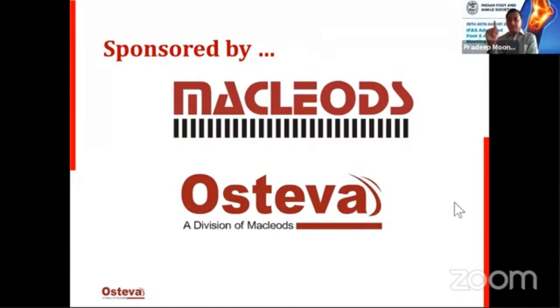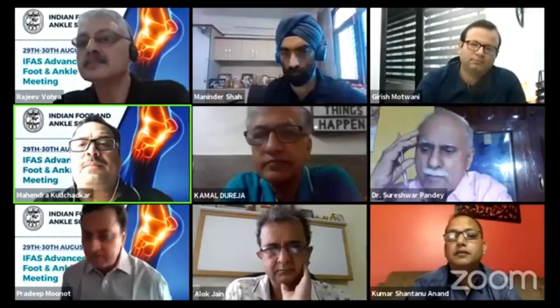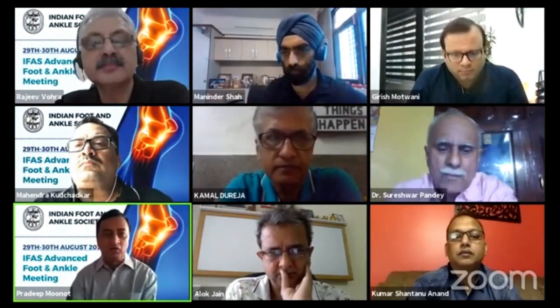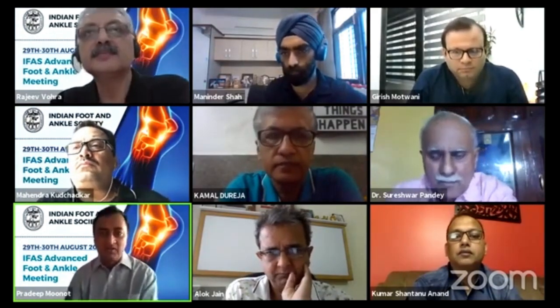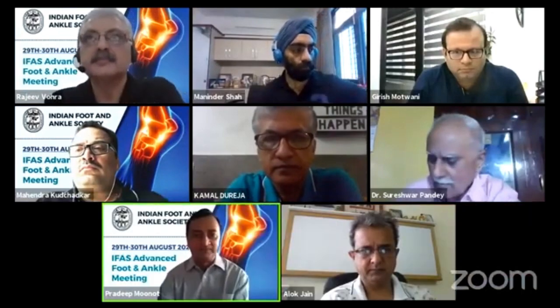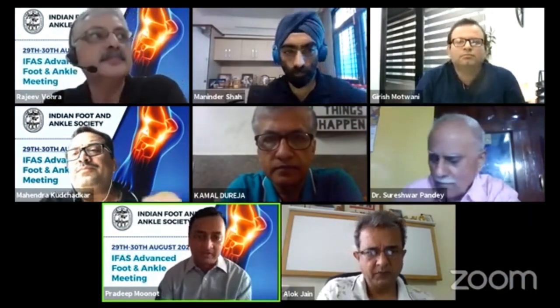Can I add one more comment, Mahendra, before summarizing? Yes, tell me. I wanted to ask Girish, since we have 2-3 minutes, what would be his indications for getting a CT scan? We know in foot and ankle we order a lot of MRIs. What are the indications for the faculty for CT scans for the ankle, other than a trauma case?